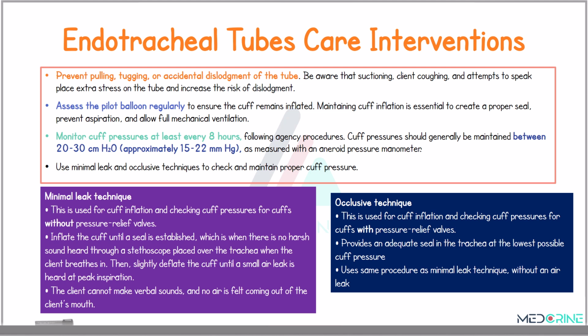Another intervention is to monitor the cuff pressure at least every 8 hours. Cuff pressures should be maintained between 20 to 30 centimeters of water or 15 to 22 millimeters of mercury. We use minimal leak and occlusive techniques to check and maintain a proper cuff pressure.